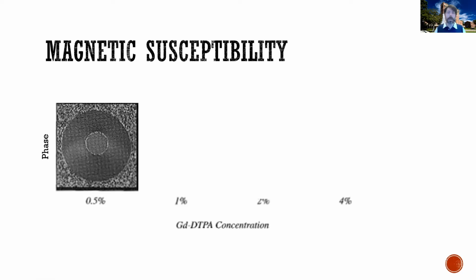And protons resonate at the Larmor frequency, which is a function of how strong the magnetic field is. For example, let's take a proton. Well, here it is. Now, this proton happens to be in this sort of dark gray part of the field, and so is resonating at a certain Larmor frequency. And here I'm using the color of the proton to indicate its Larmor frequency.